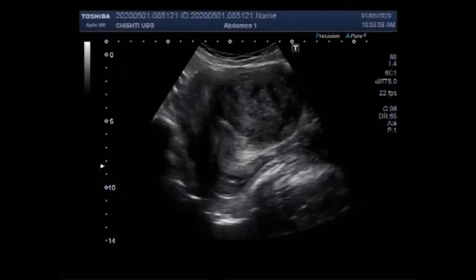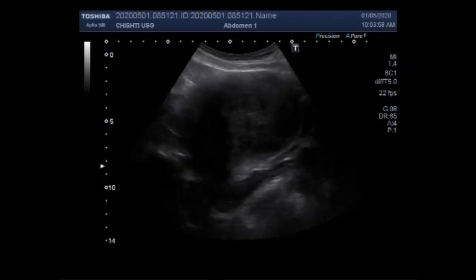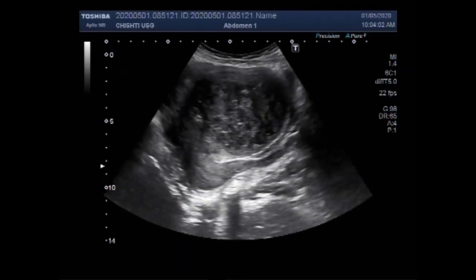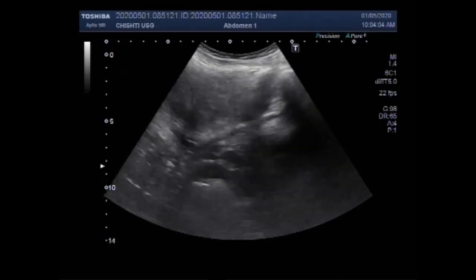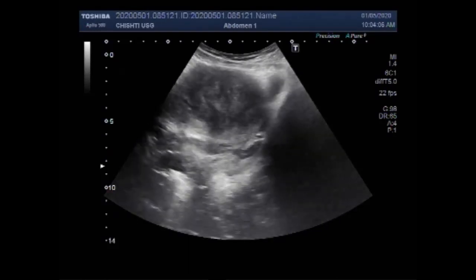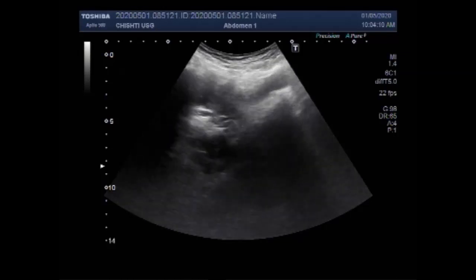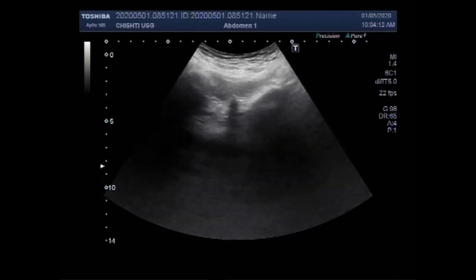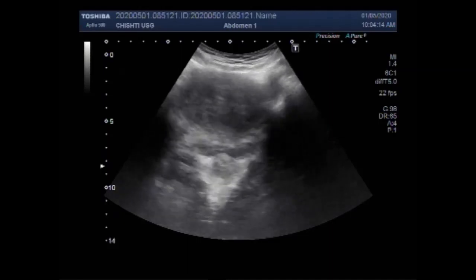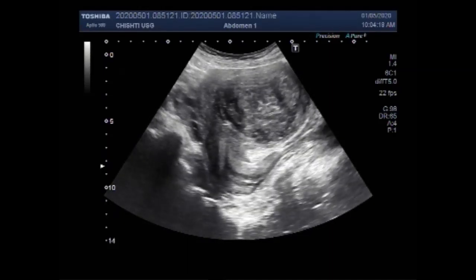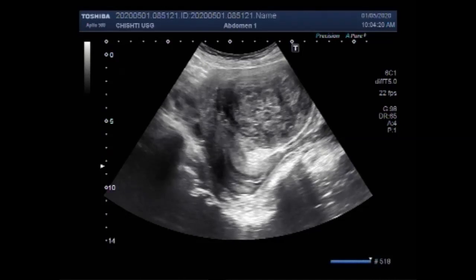Dear viewers, I hope you are all fine. This ultrasound video shows a case of ovarian mass. The ovaries are the sex organs that produce female hormones and store and release eggs between puberty and menopause. An ovarian mass may be a cyst or a tumor growth, which may be non-cancerous (benign) or cancerous, developing in one or both of the female's ovaries.